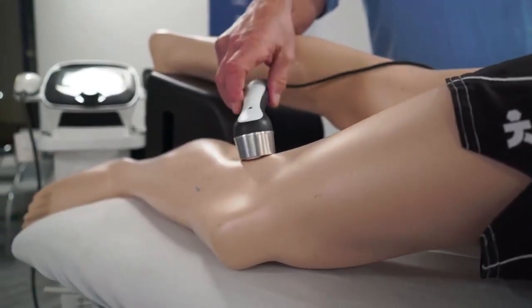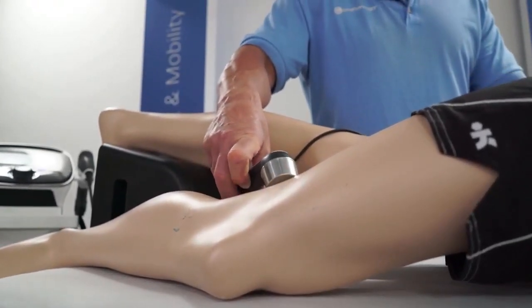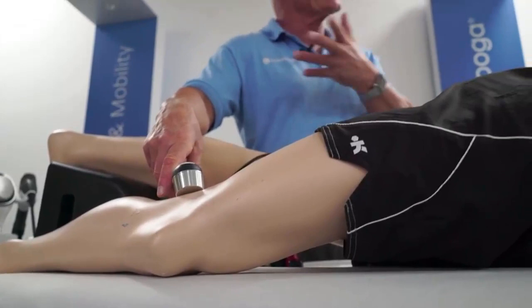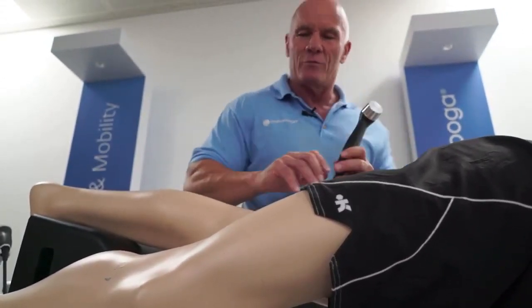Yeah, and therefore I suppose if I had the standard 5 centimetre, it's going to double the time. It would be a longer treatment. Okay, so I'll double the time to get the same amount of energy in. Okay, perfect. Okay, well done. Excellent. Well, thank you very much indeed for that. I've learned a lot from that.